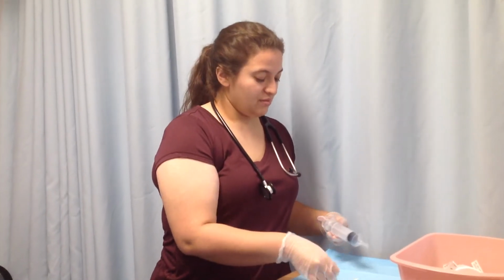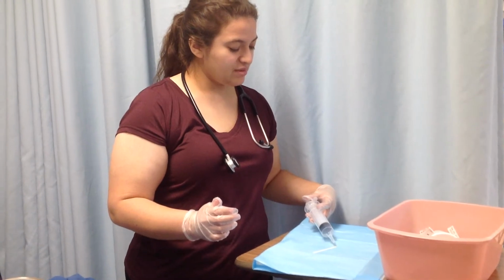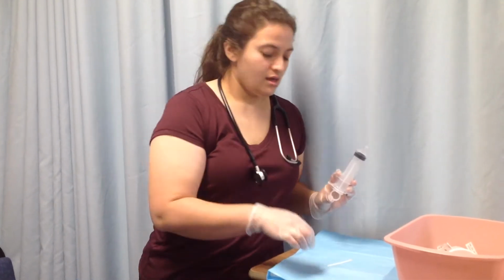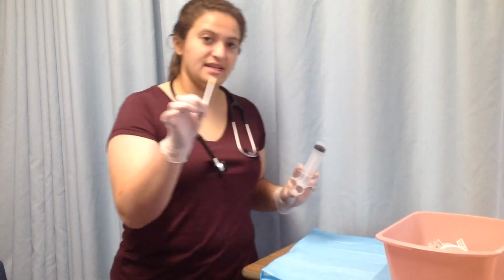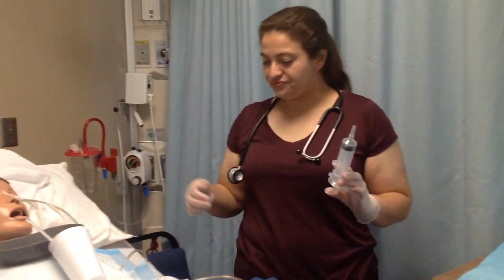So I would go ahead and take my pH strip and place it on there. And I'd put just enough stomach contents to check the pH. And you want it to be between 0 to 4, so if it's less than 4, then that's usually normal. And then I would take this strip and throw it away, and make sure to document that.